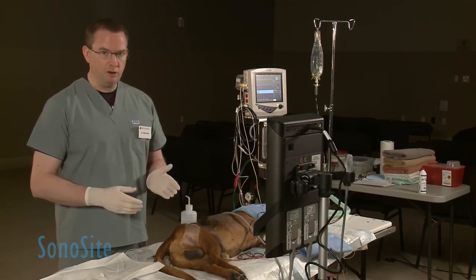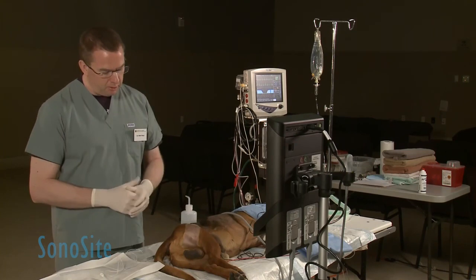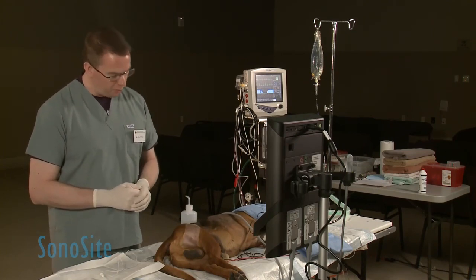We've already done a sterile prep — three different scrubs of chlorhexidine and a final prep of alcohol at this point.